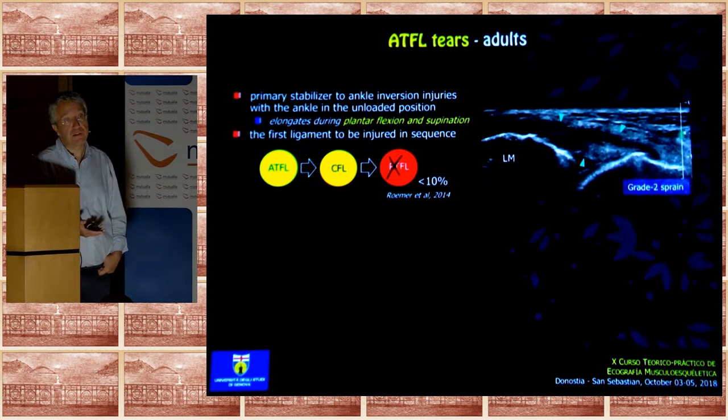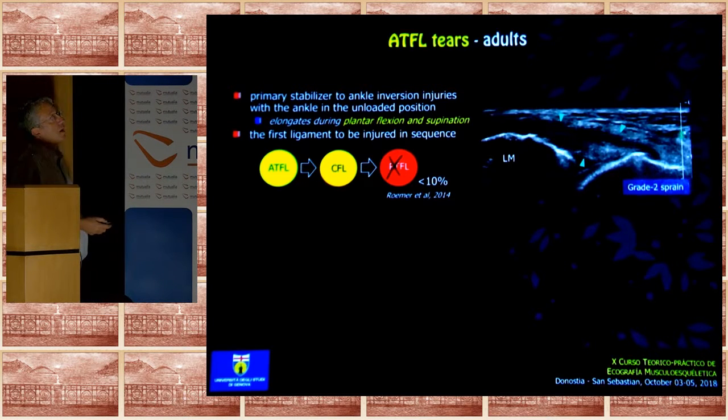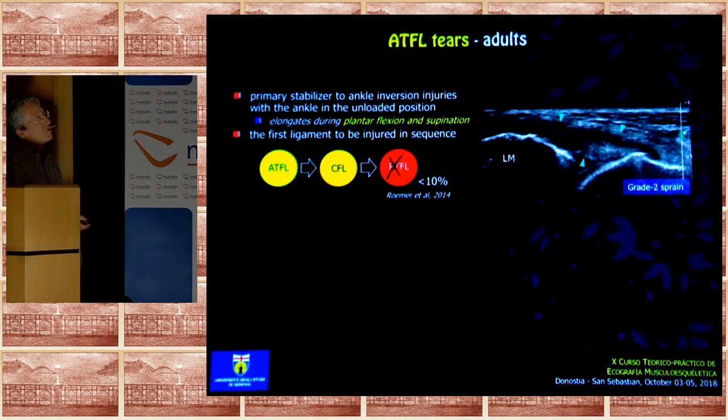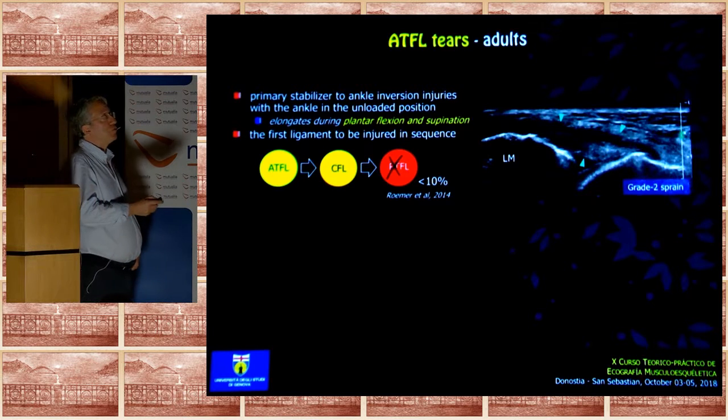And this is good for us, good for ultrasound, because ultrasound is able to see something about this ligament, the level of the insertion of the posterior talofibular ligament. There is also some literature about it, but ultrasound is not able to assess the status of this ligament.